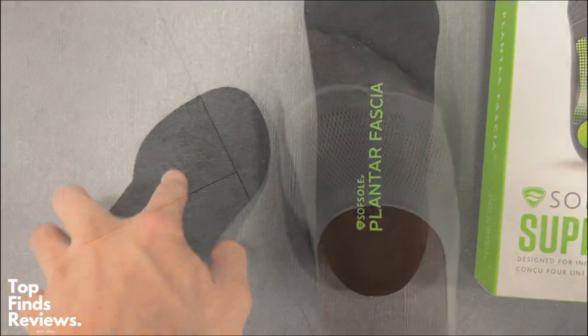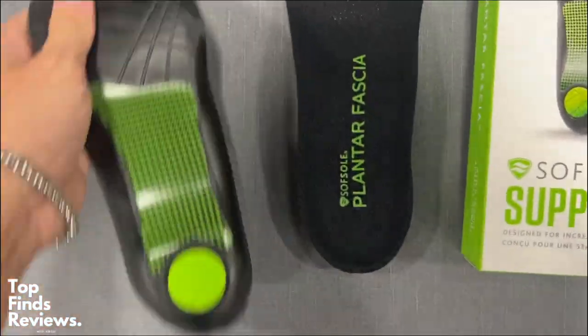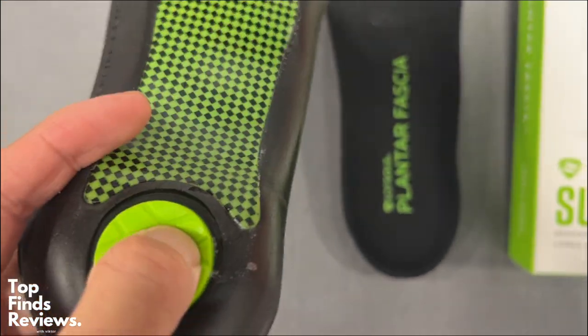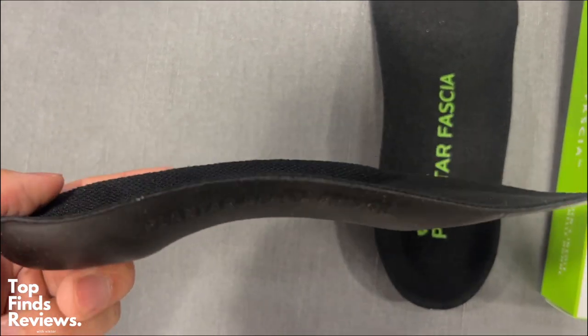This is the three-quarter length plantar fascia by SoftSoul. It's in the support series and honestly this thing feels amazing. It's got a nice soft cushiony air bubble at the heel and then a hard plastic at the arc area, and it just cradles your foot and really helps.